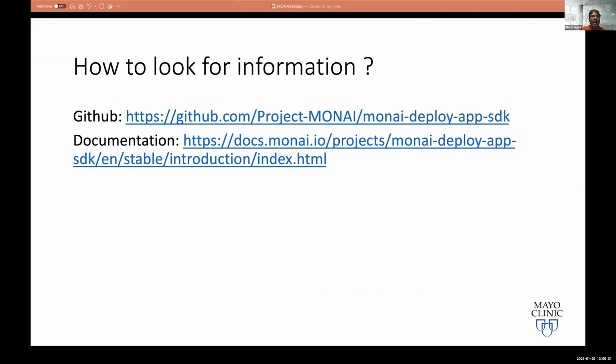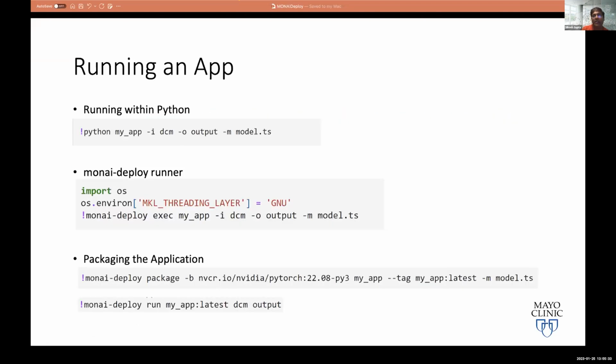I will stop for a moment here. Michael, are there any questions for me to answer? There is one, David answered one of them, but if you wanted to expand or talk about it: what format must a model be when included in a MAP? TorchScript? Are there any other specifications for what can actually go into it? And you've been expanding on that, that it's not even just models, that you can do a little bit of everything.